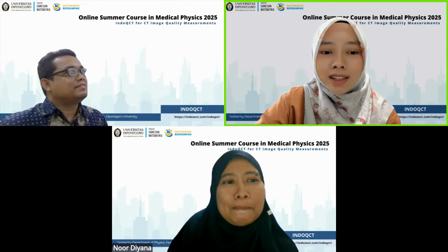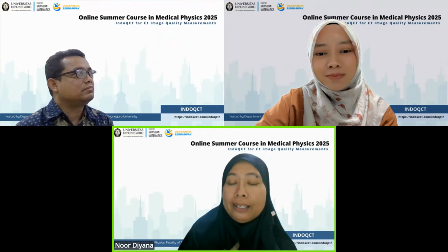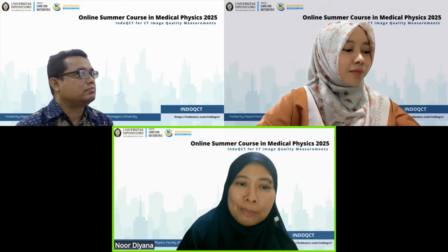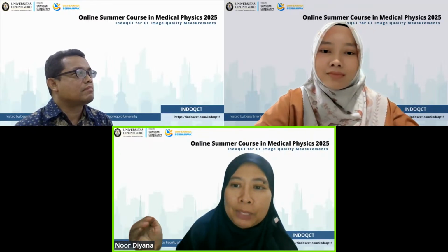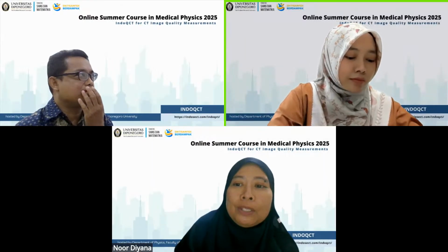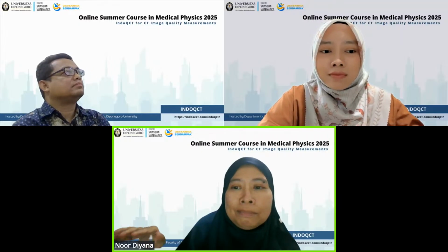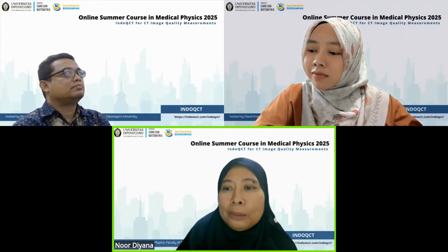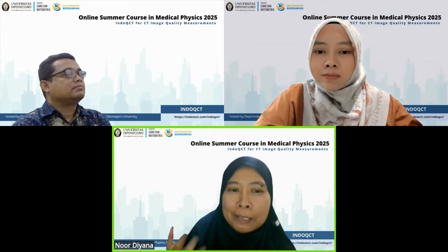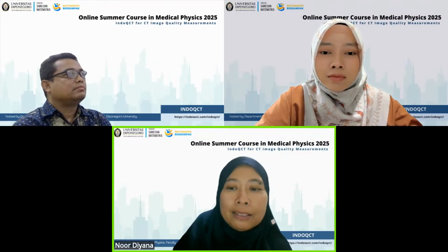Maybe from Dr. Nordiana first. Okay. For my routine QA, I usually use the parameters recommended by the manufacturer. It's a standard dose CT protocol. So I never use high dose and I never test it. Maybe this one can be asked to Dr. Anam, because usually the scan protocol that I use is based on the manufacturer's recommendation.